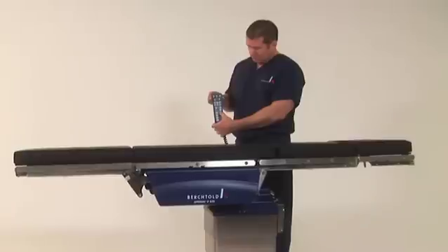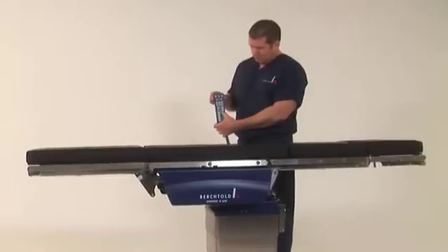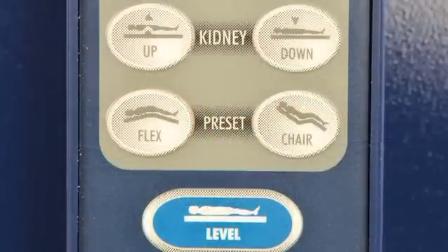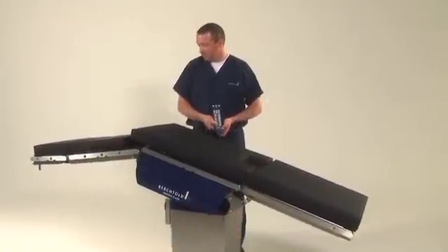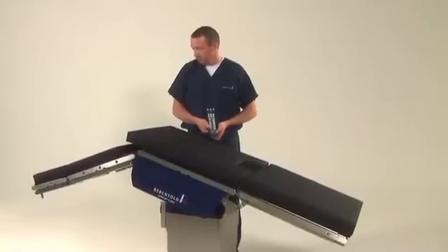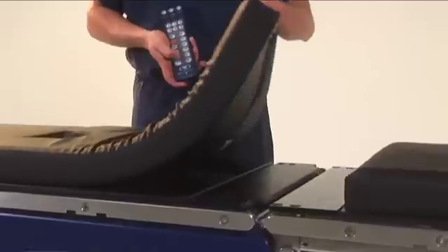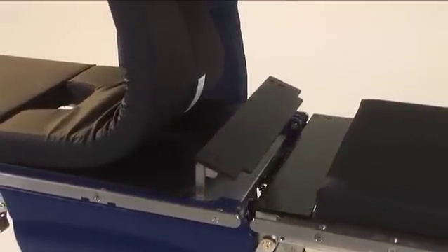Before using the flex articulation, the table must be slid all the way to the head first. Once the table is positioned at the head, press and hold the flex key. The table will automatically begin a reverse Trendelenburg motion, and the back section will drop. The table will repeat the motions until the desired amount of flex is achieved. To create better site access for lateral positioning, the power kidney elevator can be utilized.